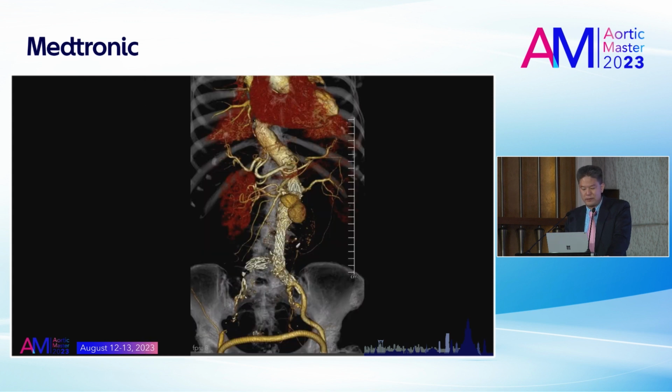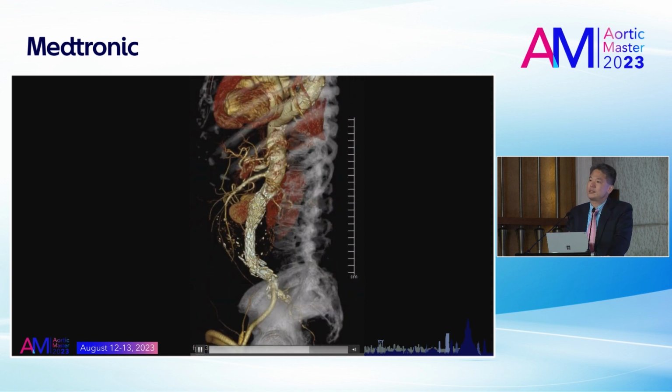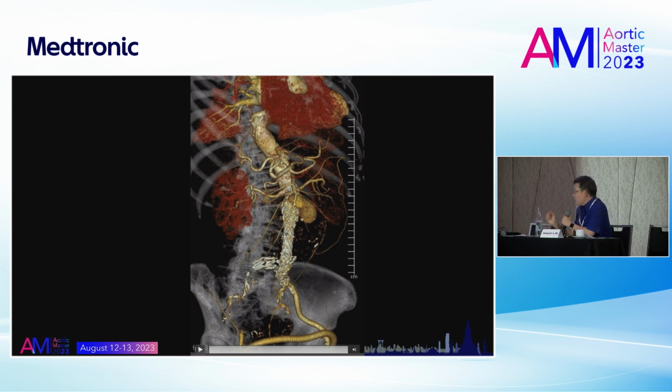And the patient was an 85-year-old female. So what should we do now? Open the patient and do a banding, or extend the sealing zone? Now we ask Ajahn Vira, what will you do? Will you do the banding, or will you do the extension, or will you do the EndoAnchor if you have it available? Chimney.